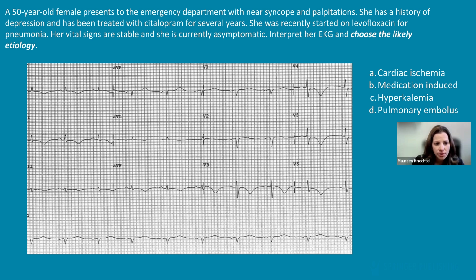And when you think about QT prolongation, I want you to always remember three things that you want to look for. So one, you want to think about cardiac ischemia. Of course, ischemia can cause QT prolongation. And then the patient can have medications that are doing this, QT prolonging medications, like in this case, and then hypokalemia, low potassium can increase the QT interval.